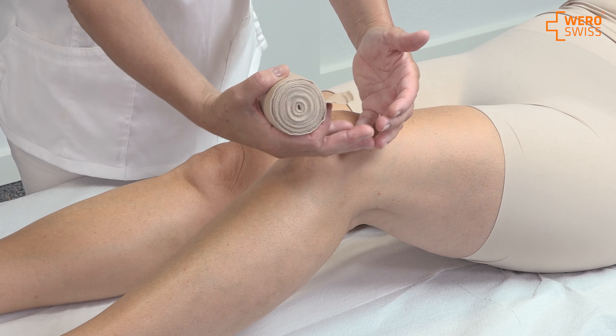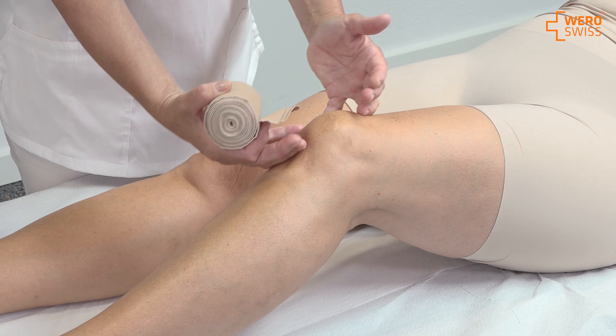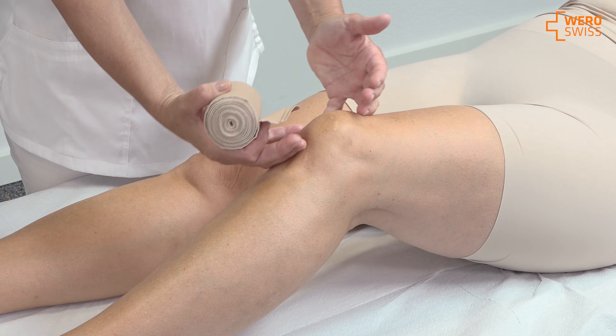There are two options regarding the knee bandages. You can either leave the patella open, or you can make the bandage on top of the patella. This depends on whether there is pain on the patella — we leave it open, and if it's okay we cover it.